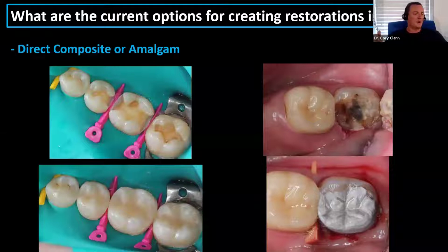I think there's a few more coming. Ceramco's Crown Tech, Envision Tech's got one. I forget the name of it, but these materials are super exciting and they really do an excellent job. I've been incredibly impressed with the results. Again, I'm not clinically practicing anymore, but I am doing these for other people, and they're testing them out for me. And just as an example, I've printed a crown out of this material and then stood on it with my boot on a concrete floor without breaking. So that says a lot.